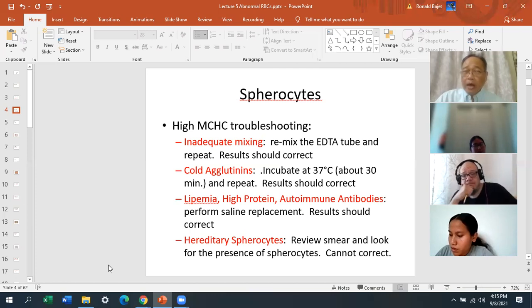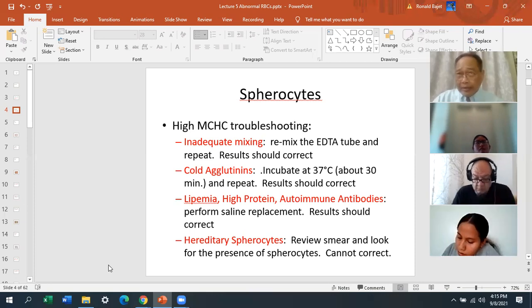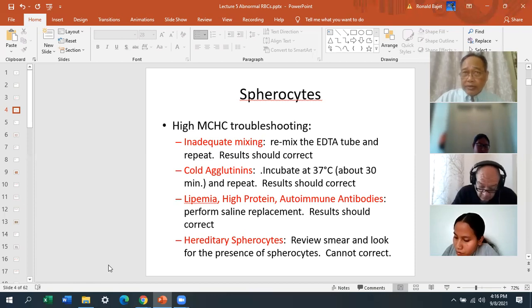That's lipemia. Another thing is called Icterus, and I touched upon that last week. If you have liver disease and you spin it down, if it's white, it's lipemia. But if you spin down a sample of the blood and it's really dark amber, green, or orange, it's usually greenish, or it's kind of dark. Remember, the color of normal plasma is yellow to light yellow. But if you spin it down and you see it's kind of dark greenish, really orange green, that's Icterus. That's called Icterus.